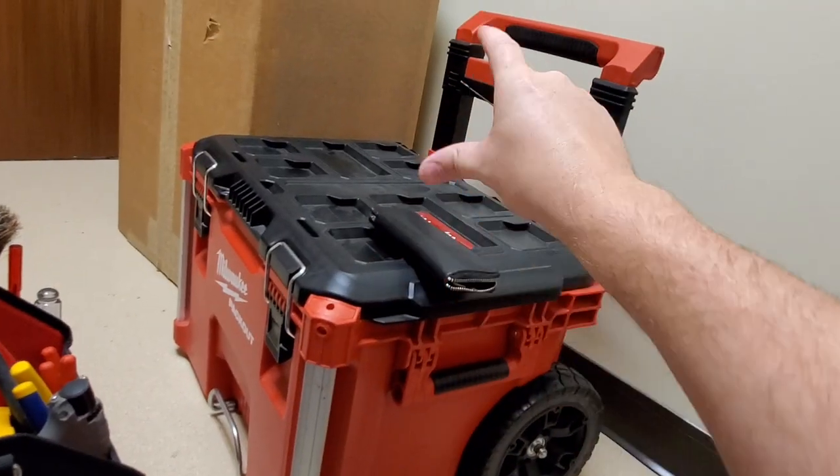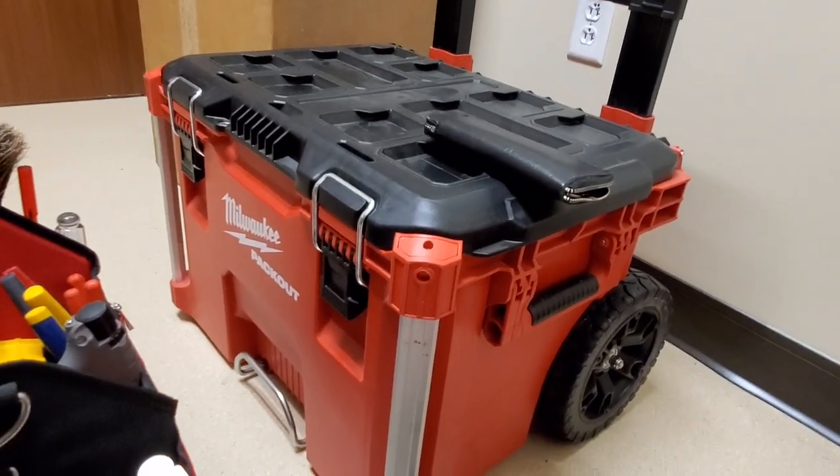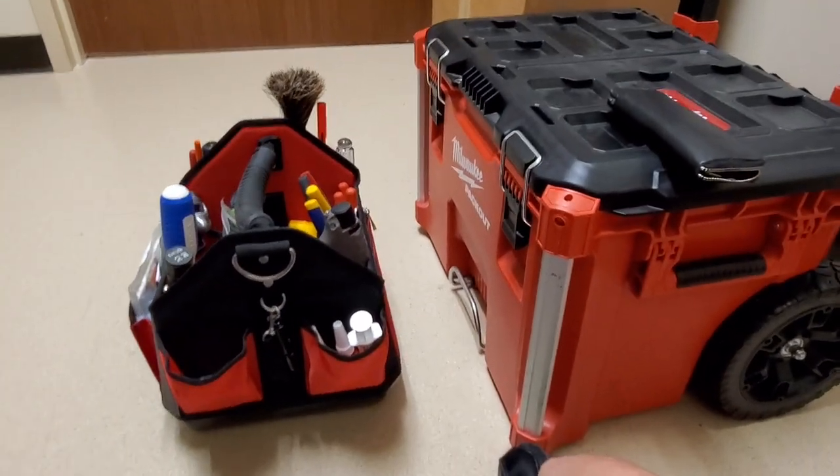Next spring they're coming out with a three-drawer set for the Milwaukee Packout, and when that drops I'll probably reorganize again and show you guys what I've come up with. But this system is going to be absolutely awesome on a medical campus as big as mine — every little advantage saving time and energy is a huge plus. The ability to wheel equipment back when you're doing PMs in the field and find something broken is going to save so much time.